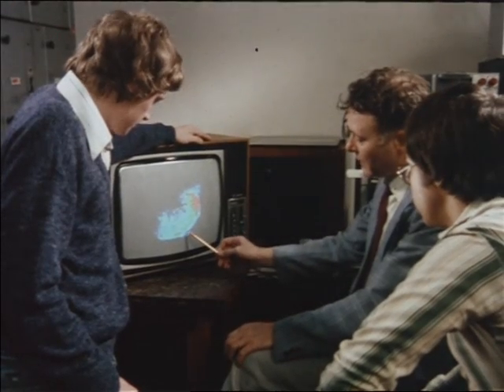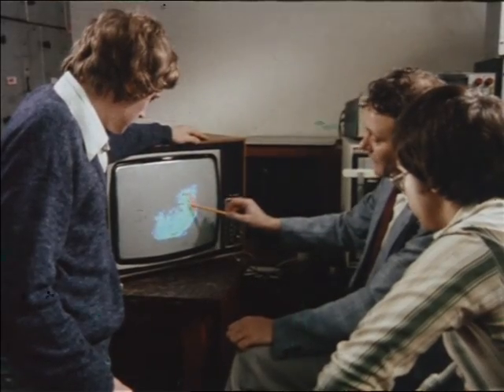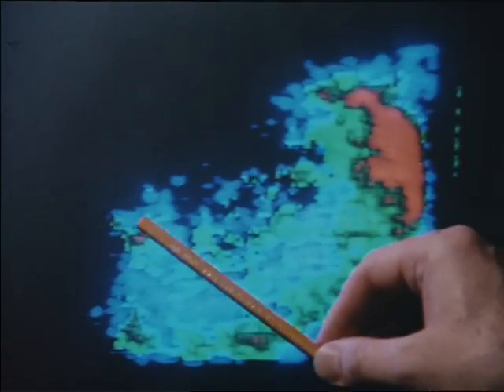And this is looking from the rear. This is the stomach region, which hasn't come out very well at all, but you can see these little convolutions here, which are probably intestines or something showing through here. The obvious feature here, of course, is the liver, which is coming out really rather bright red. And this is, we believe, the left-hand lobe of the liver just showing through here. And there's the higher proton region just underneath it. Well, this blue demarcation, I think, shows the spleen area.